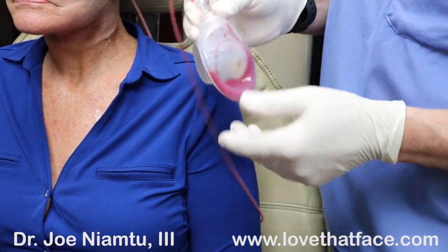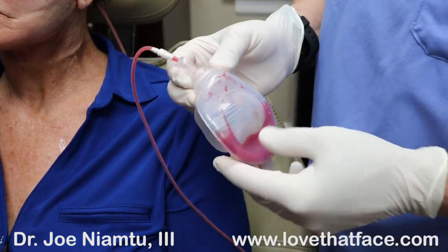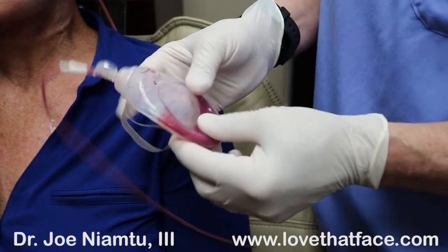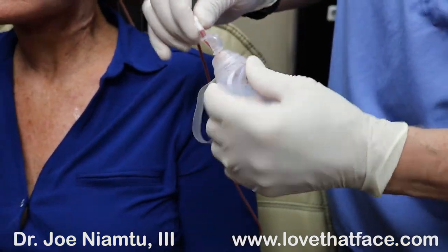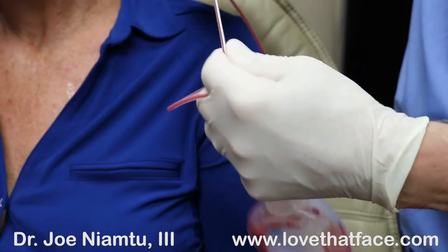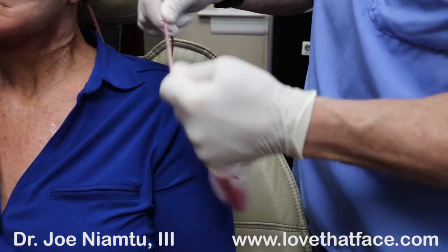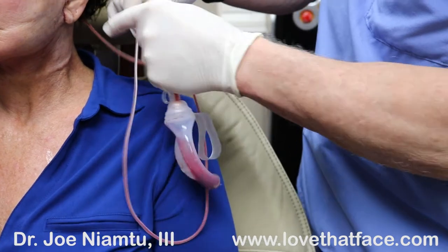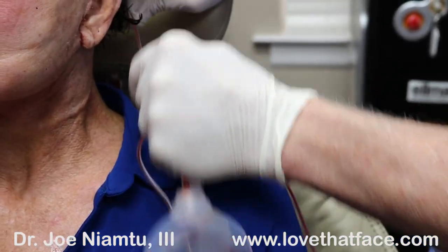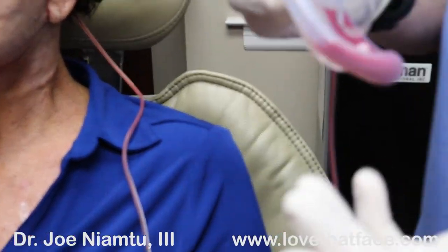For drain maintenance: if the drain gets clotted or stuck, it won't work. First, make sure it's always compressed and in charge with active suction. If you get a little clot, you can wiggle the tubing. You can also hold it between your thumb — so you're not pulling on the skin — and stretch it back and forth along the length of the drain. When you get up towards the anchor point on the patient, make sure you're not pulling so you don't pull it out.